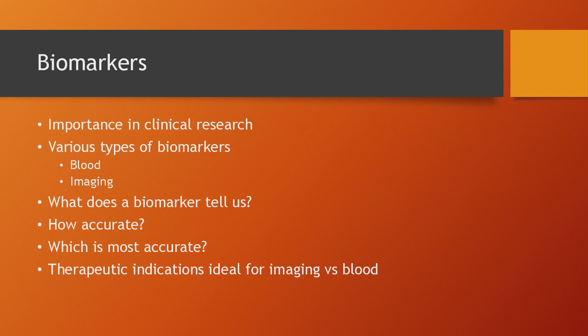So as of now, although there is no consensus on metrology aspects of imaging biomarkers, we decided to, let's say, bring the requirements or the limitations from the blood test. So since there is no standardization, we thought, okay, how can we ensure that our measurement techniques that extract imaging biomarkers from CT, MRI, or PET imaging or X-ray, how can we validate them? How can we establish a methodology for validation?